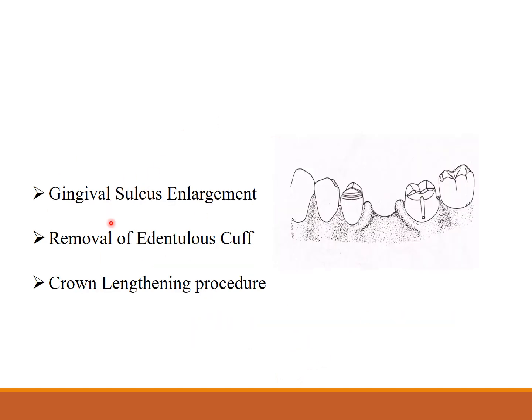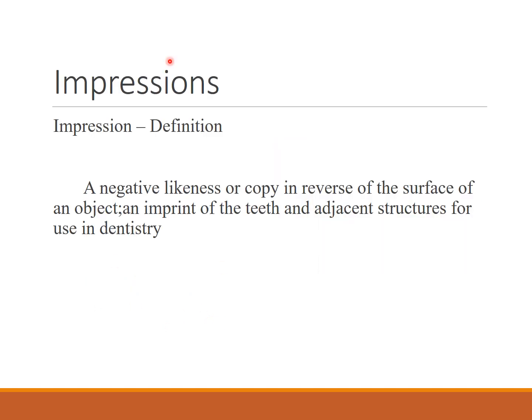Gingival sulcus enlargement, or removal of edentulous cuff, or crown lengthening procedure. In these indications, it can be used. So that was the end of the gingival retraction and the types and the techniques used.